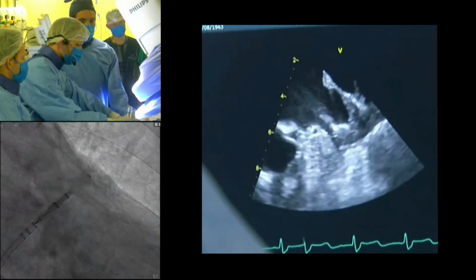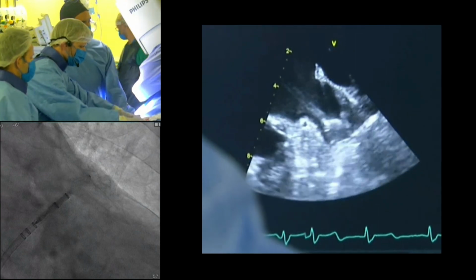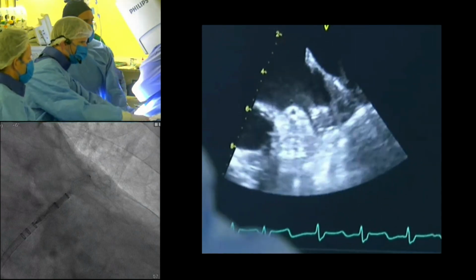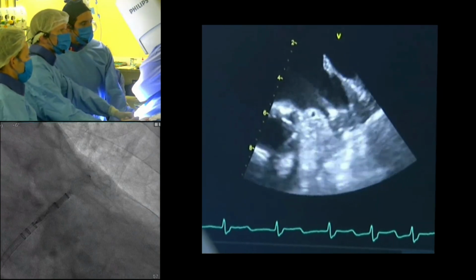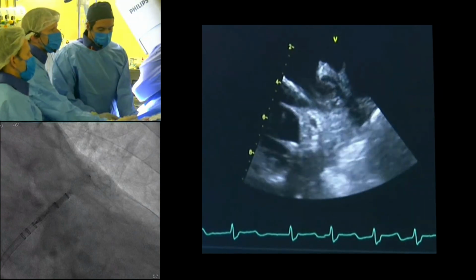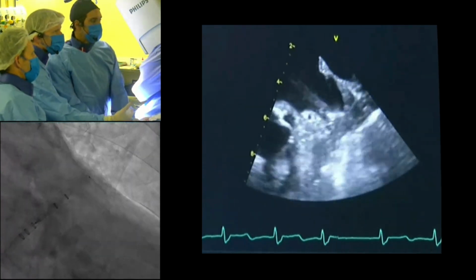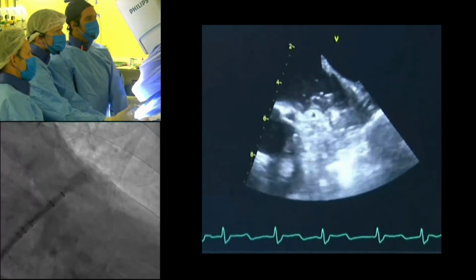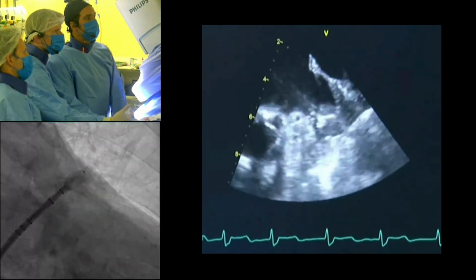From the echo, I'm pretty sure you guys all can see the ball is around half, or maybe 1 centimeter distal to the circ, which will be a very good attack position for us. Don't you think, Oli? Yeah, I agree. If the ball is roughly 1 centimeter distal of the circ, it's typically good. So okay, let's make a cine now. Yeah, a short cine, a little bit of contrast.